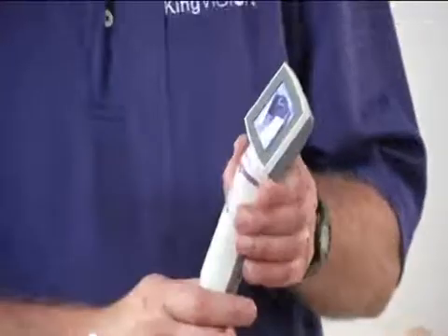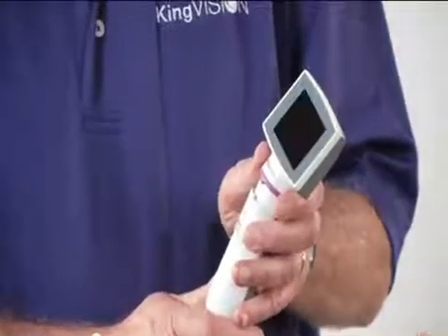So to correct that, you just power off and back on again. Now, if you disturb this connection after it's been attached, then one of two things will happen. It will either provide a frozen image, or the screen could go blank, like that.